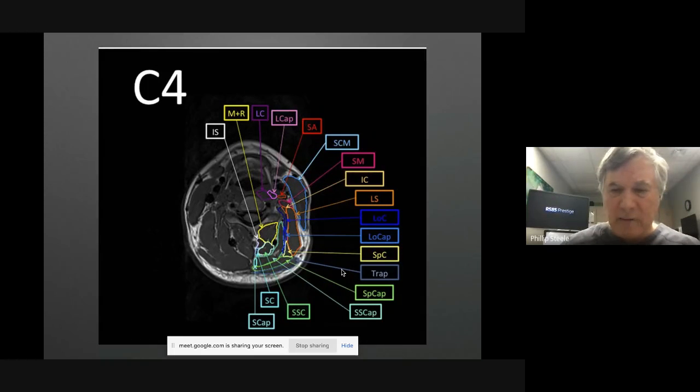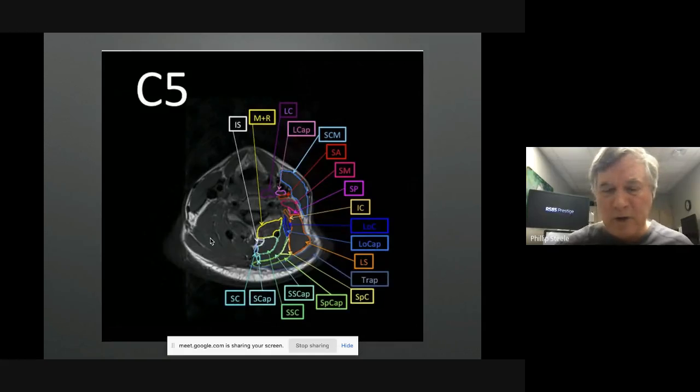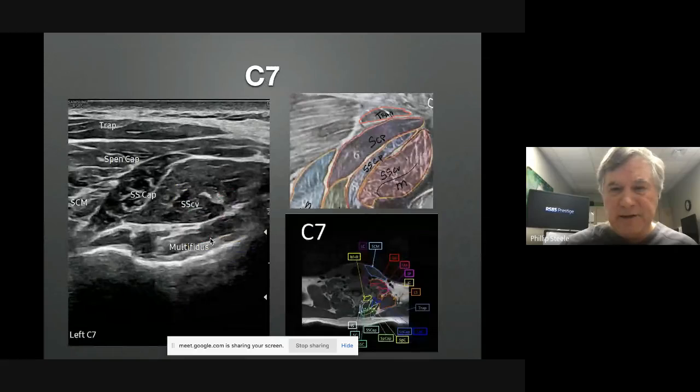Again, I would pull this article. It's incredibly valuable. There's very little written about these relationships and how to identify pathology here. This is a journey well worth learning. It takes some time. I came in on a lot of weekends and scanned a lot of necks to identify that, but you'll start noticing scar tissue formations, all kinds of things as part of chronic pain, and you can identify pathology that you were completely unaware of and would not normally address in a normal Prolo technique.